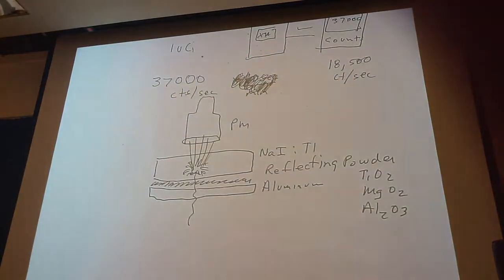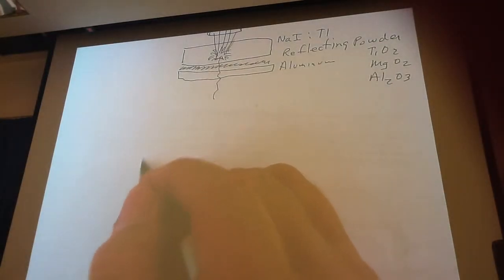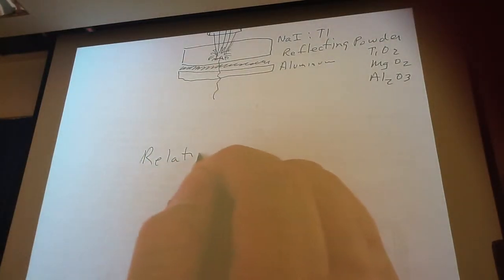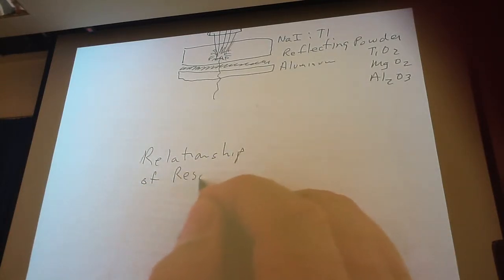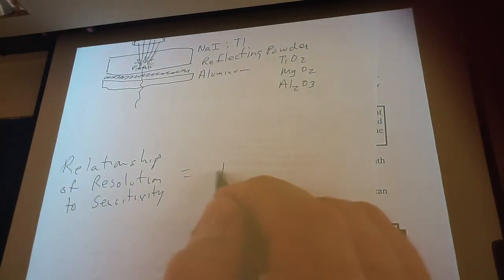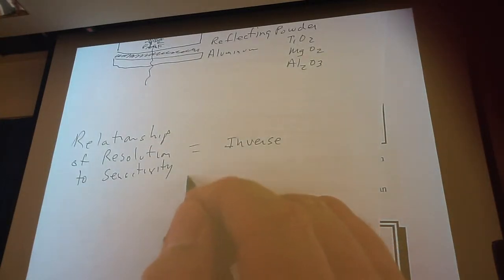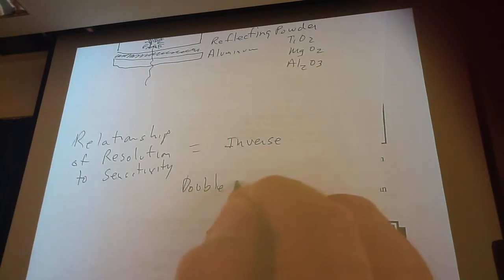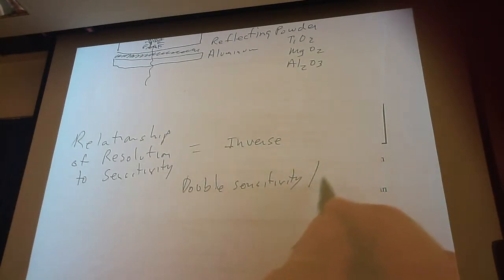One of the questions that they always ask you is, what is the relationship of resolution and sensitivity? And as Greg said, it's an inverse relationship. If I double the sensitivity, my resolution is cut in half.